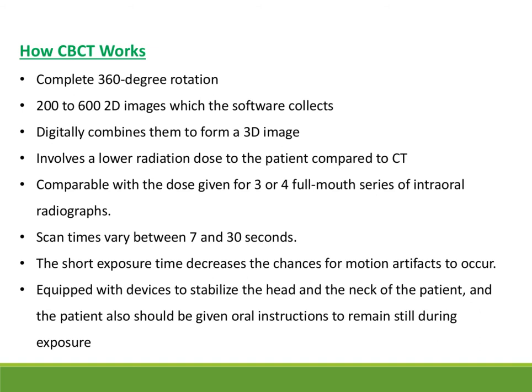Scan times vary between 7 and 30 seconds. The duration has become less. The short exposure time decreases the chances for motion artifacts to occur. Motion artifacts, for example, the patient moves, the X-ray tube head moves like that. Okay, so that is also not there.